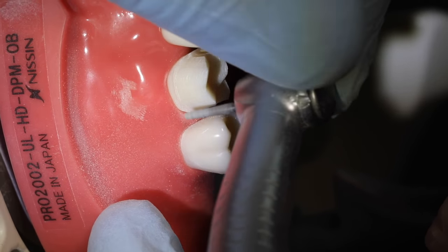Okay, now we'll move to the lingual. One of the things that you'll find with upper posterior, upper anterior teeth, really anything that isn't an upper second molar, and sometimes we do it on second molars also, is you'll need to do two-plane facial reduction, where you take the facial surface axially down in two planes to help line things up. And if your axis is quite a bit to the buccal, which this one is, you invariably have to take some off of the occlusal two-thirds on the buccal aspect. So we'll come back to that later after we've lined all of our axial walls up and do a second facial plane of reduction. So let's key off of our axial wall out here that we've already reduced, line up our handpiece, and we'll start on the lingual now.